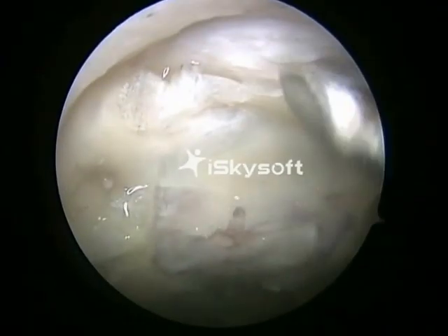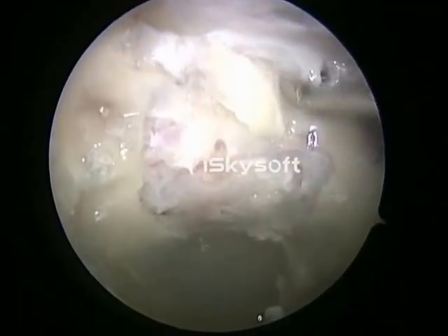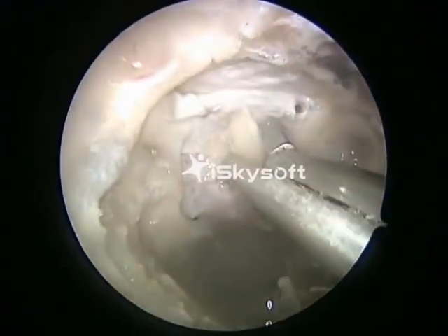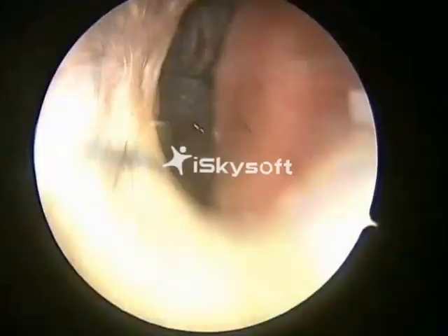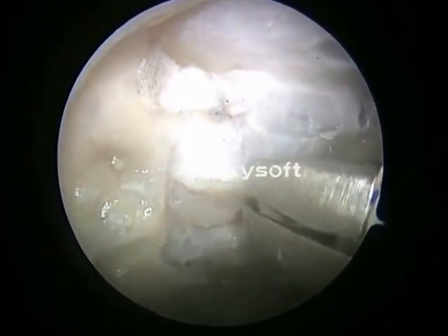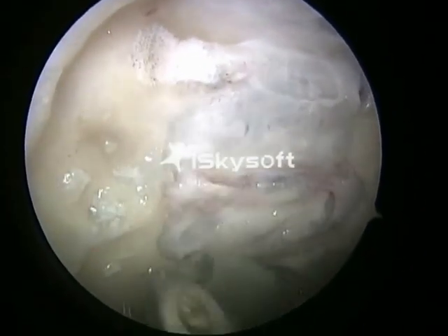Now the bone is removed from the planum sphenoidale. That's a triangular piece of bone, the wedge. And once we do that, that's a triangular piece of bone on the planum. And this is the bone in the tuberculum sellae region.